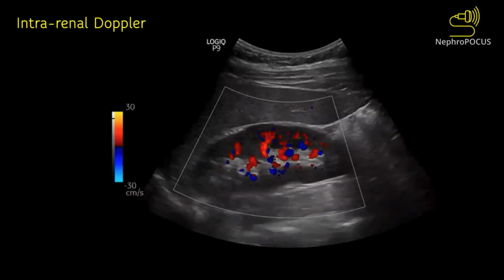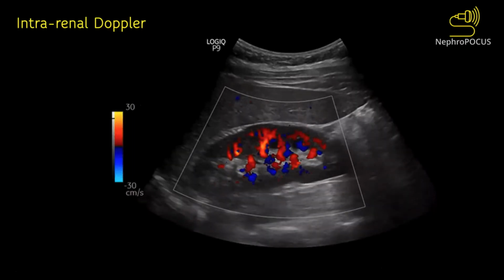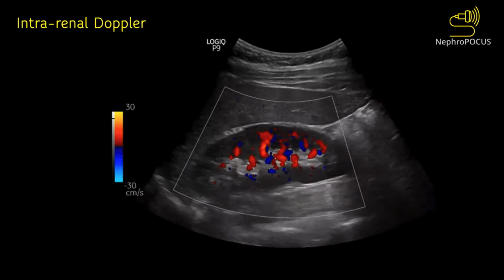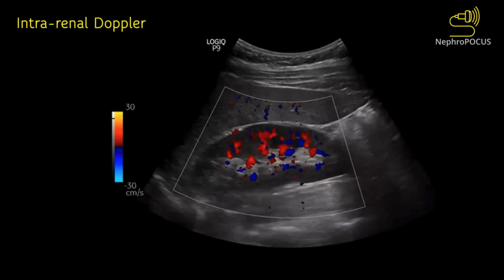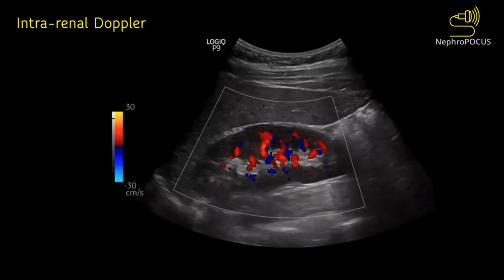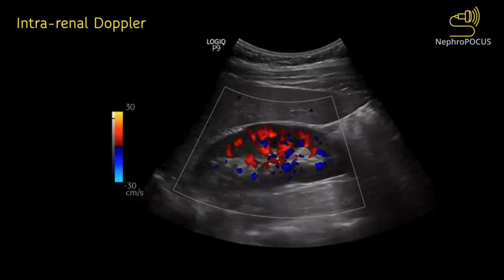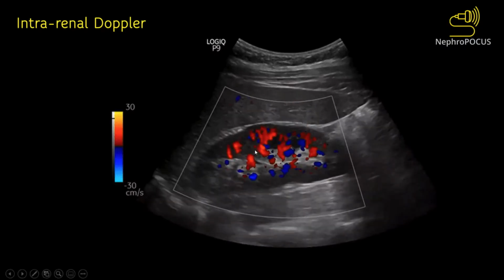I'm not going to talk about hepatic or portal waveforms, just take a closer look at the intrarenal Doppler. To get a good intrarenal Doppler, first, obviously, you have to get a good 2D image of the kidney, and then turn on the color Doppler. Not every patient has nice color Doppler images. Sometimes putting on power Doppler helps because it's a little more sensitive than color Doppler to identify a vessel. And you want to do the Doppler within the kidney, because the kidney is a closed system, and all this elevated venous pressure and interstitial edema from that leads to a renal tamponade. So you want to see how the kidney parenchyma is feeling the pressure.